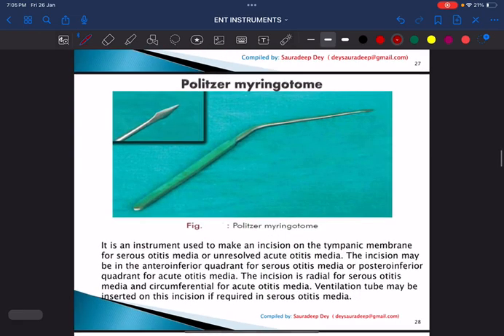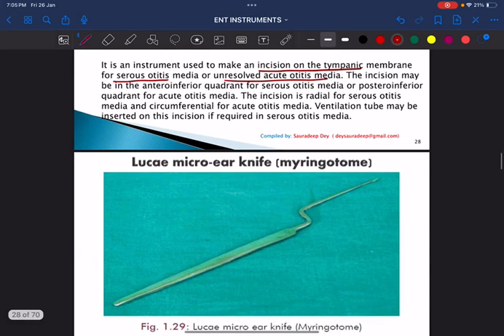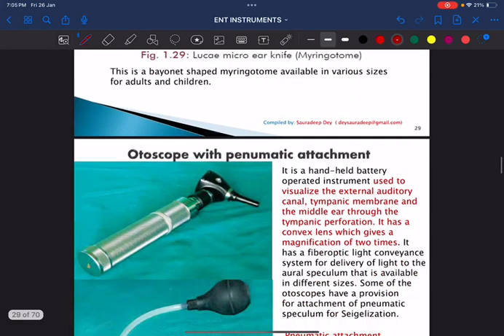This is the myringotome. It is an instrument used to make an incision on the tympanic membrane for secretory otitis media or unresolved acute otitis media.